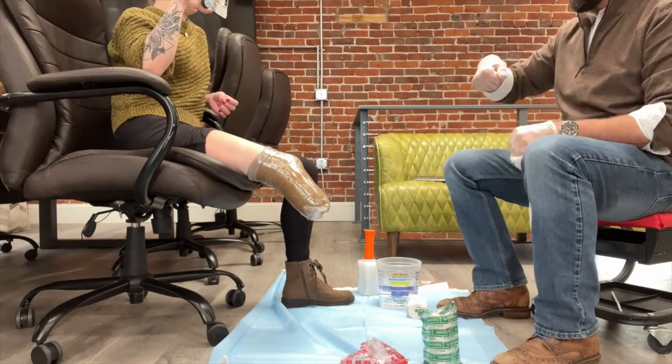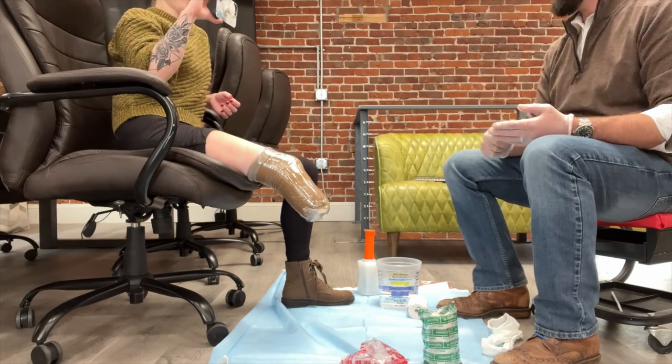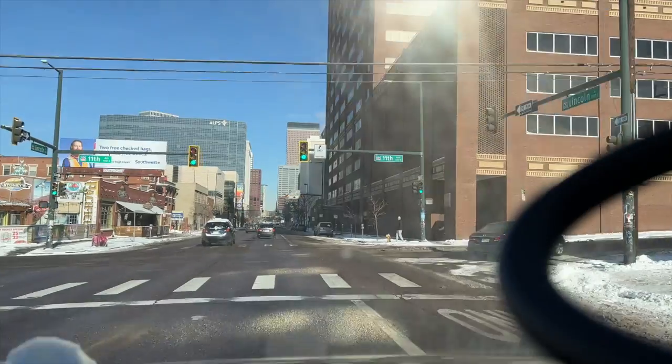Trace finished up the casting of my leg and had me come back a couple days later, because of time constraints, to actually try out this pinlock system. Today is the day. I just made it up to Extremity here in Denver and I'm gonna be trying on my newly minted pinlock socket. I have never used these to walk. After last week and doing the initial casting, I am a little bit concerned that it might not be the right system for me because of how my bones are situated. We're just not sure, but it is worth a try.